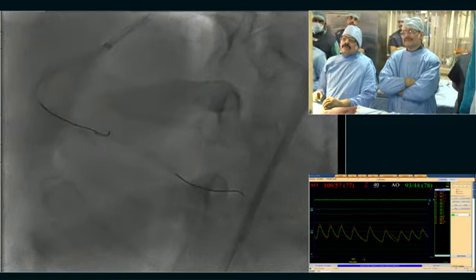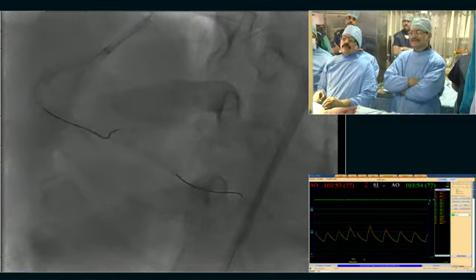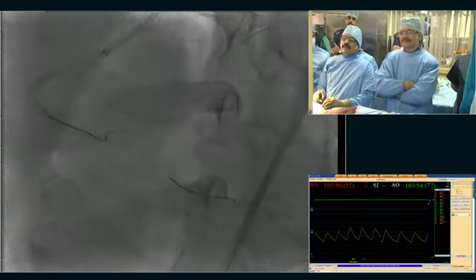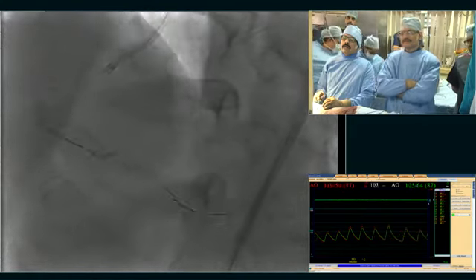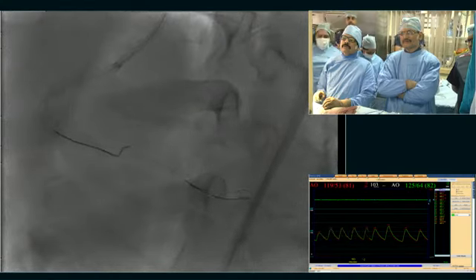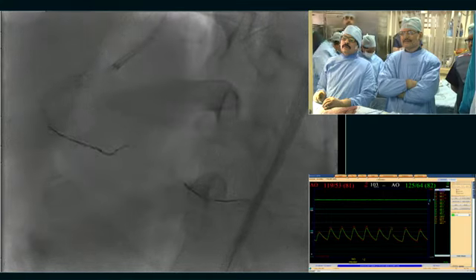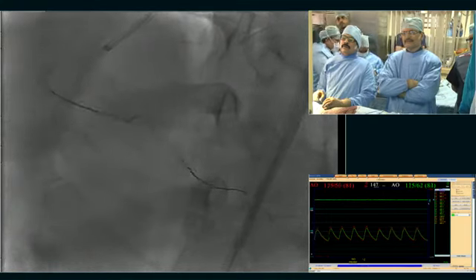First of all, at the previous stent, it went. So we have a previous angiogram. We should have seen that previous angiogram, so we know really how the distal looks and what was the end result before, and we plan. Proper planning for the case is the key to success.